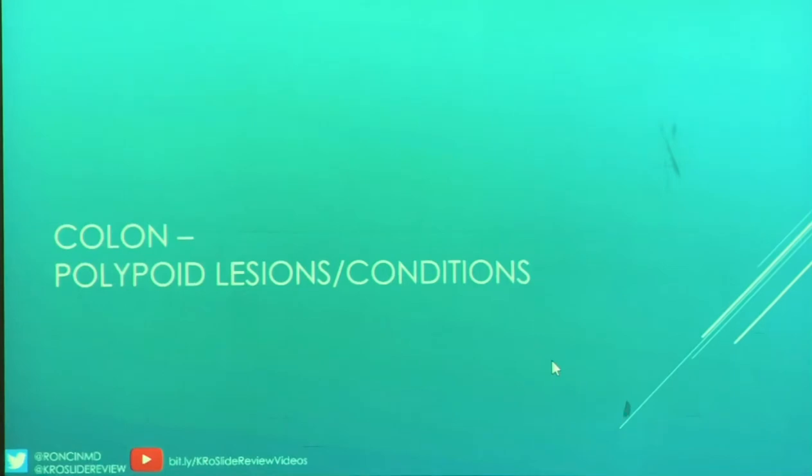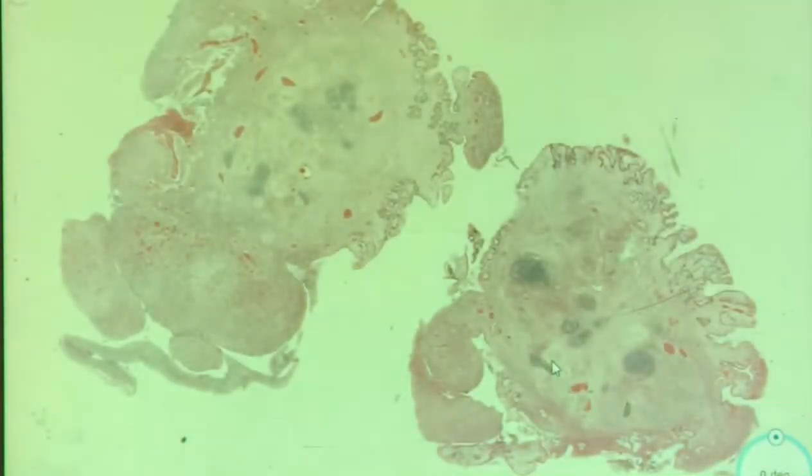So now we're going to spend the bulk of our time, as we did last week, on colon. This is case 3. So anything that kind of strikes you at low power? Those black spots. These areas? Yeah, and the more prominent. Okay. Yeah, so these are really prominent. And this is super pink. I'm really attached to colors.